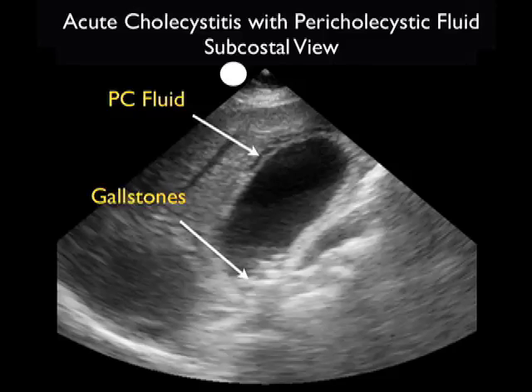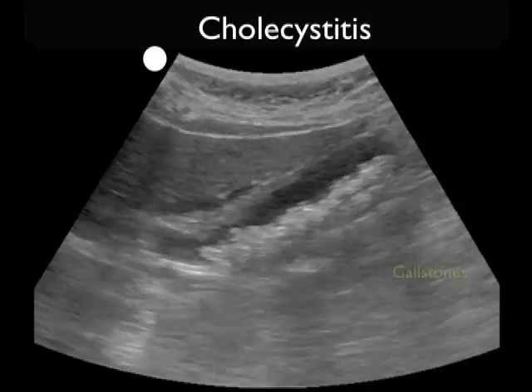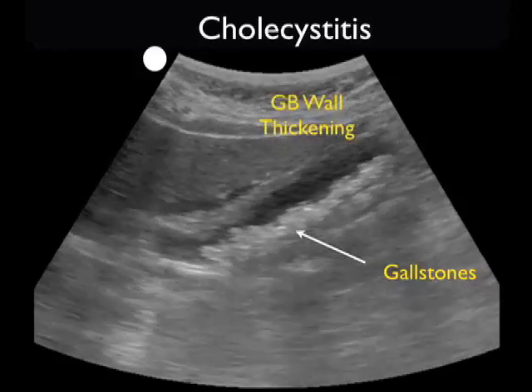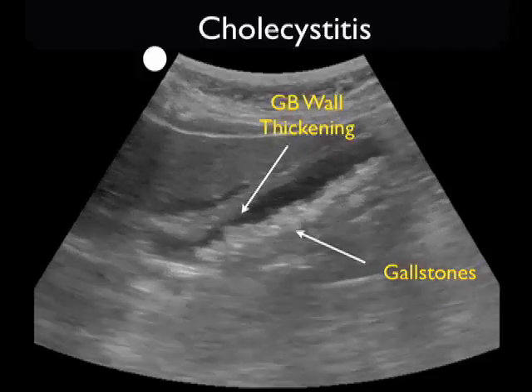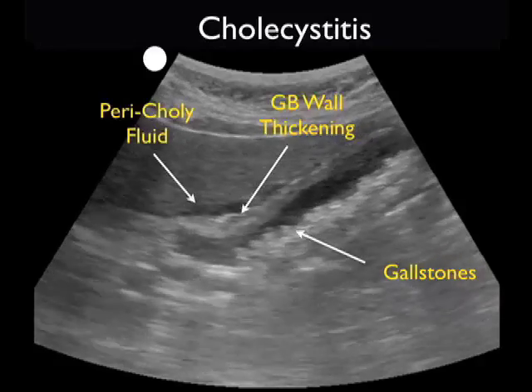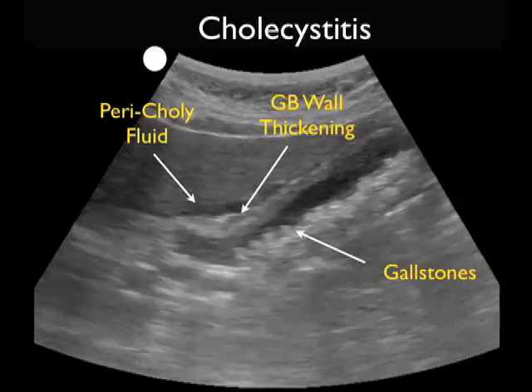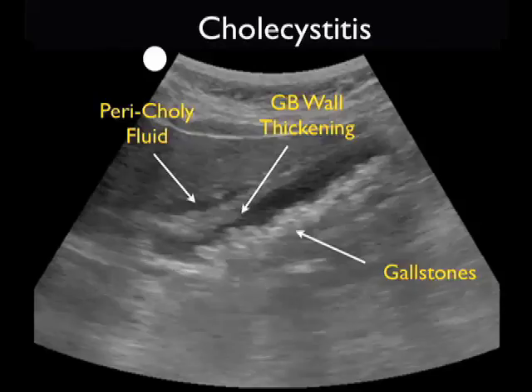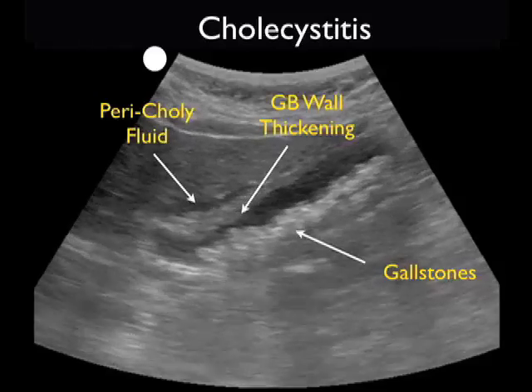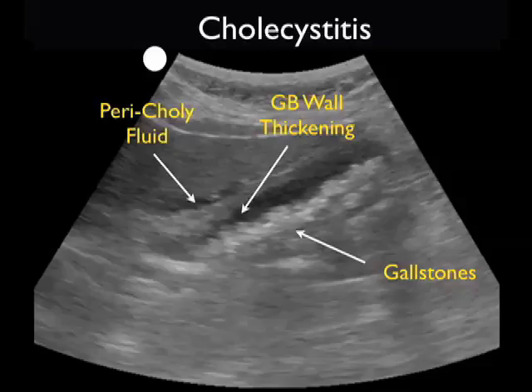So, acute cholecystitis on bedside sonography. Let's wrap this module by looking at this video clip for the multiple signs of acute cholecystitis that are present. First, we notice the distended gallbladder with a significant load of gallstones stretching across the posterior wall of the gallbladder. The patient had a positive sonographic Murphy sign, fulfilling the primary diagnostic signs. Next, let's look at the secondary diagnostic signs: the anterior wall of the gallbladder is thickened and inflamed, and we also see a stripe of pericholecystic fluid just outside the anterior wall of the gallbladder.